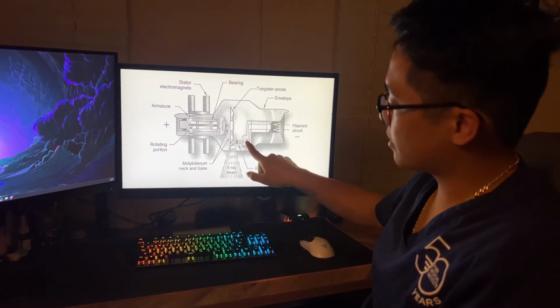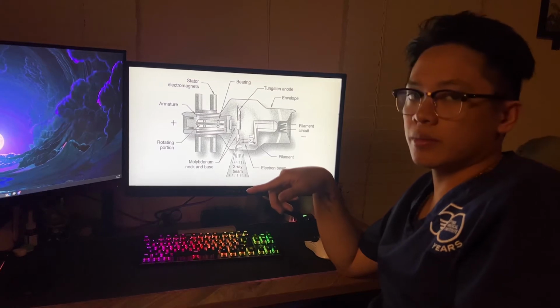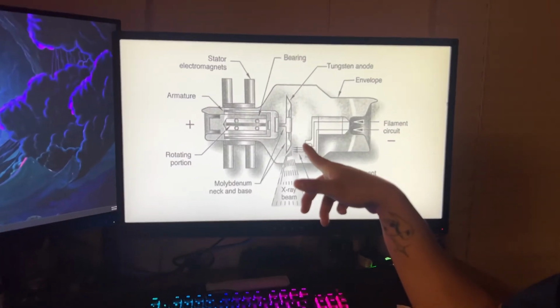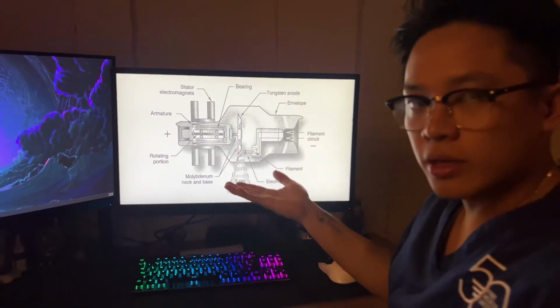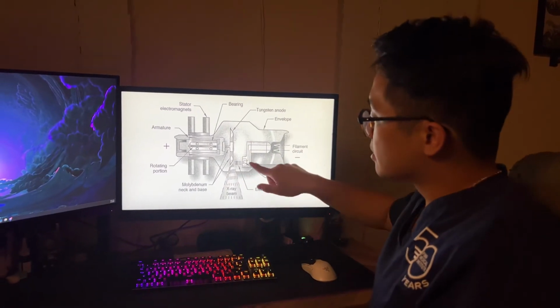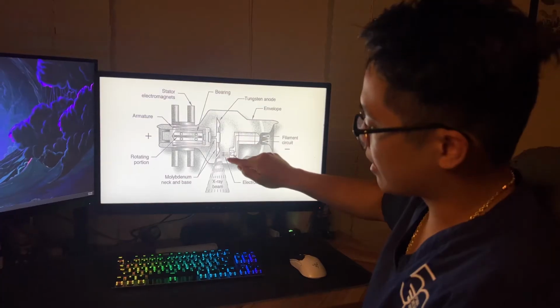We see it at this filament right here. And then on this little half square right here, this is actually the focusing cup. This focusing cup is lined with electrons right here, negatively charged electrons. So it'll repel any other charges because of the law of repulsion and attraction. It's lined with those electrons, so it'll make sure that no electrons try to go out and above. It'll just repel them down forwards.